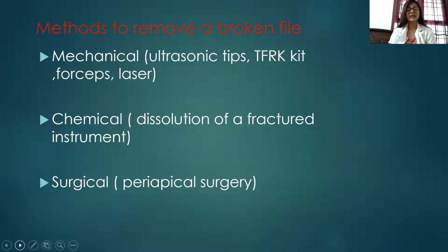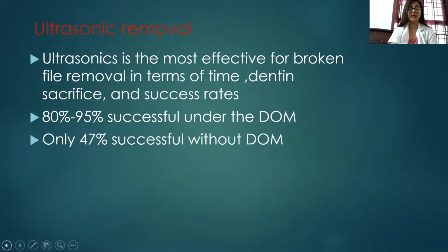There are several methods to remove a broken file. That is mechanical, chemical, or surgical. In case of mechanical, you can use ultrasonic tips, the Terauchi file retrieval kit, forceps, or laser. Chemical, by use of dissolution of the fractured instrument. Surgical, by periapical surgery.